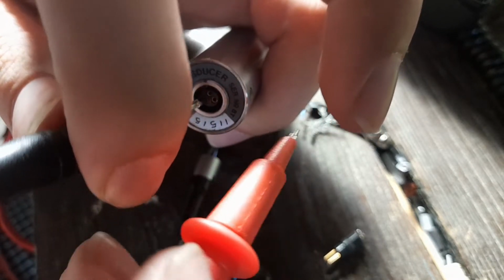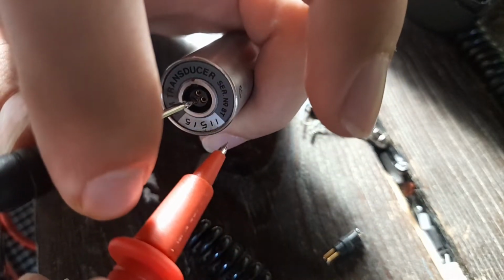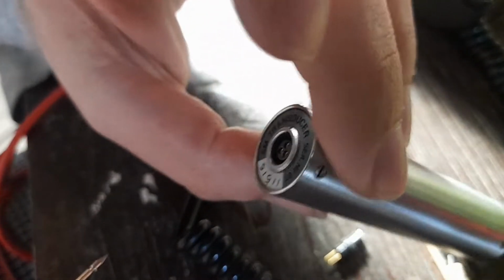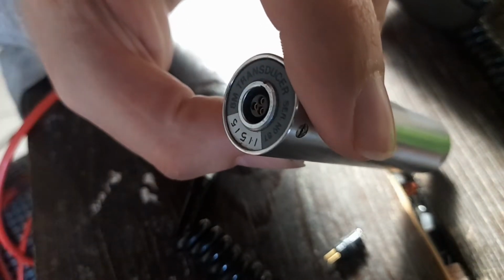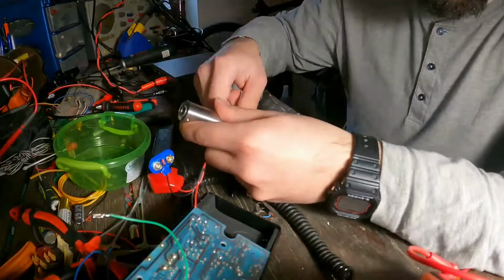It's an arbitrary assumption, and I will not base it on it to connect the cables, because I don't want to destroy this. So I will disassemble it and figure out which of those two pins is the signal pin, the audio signal pin.